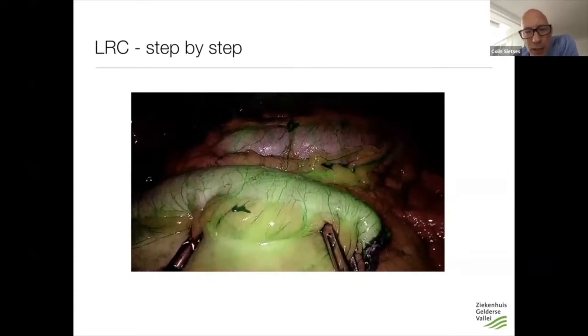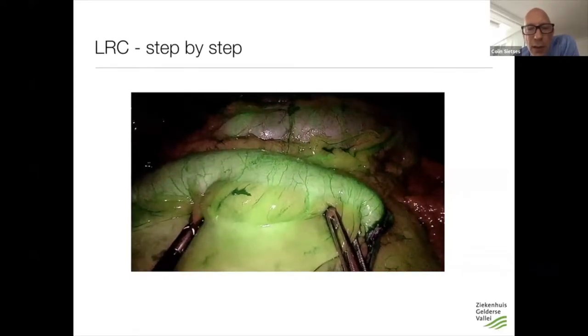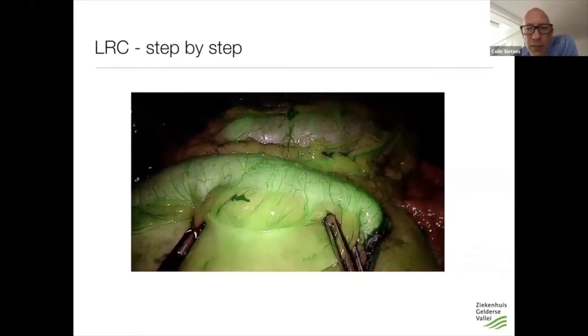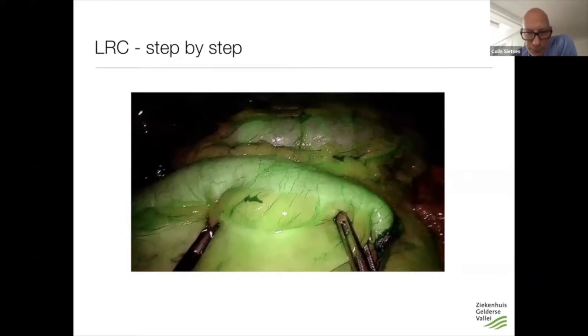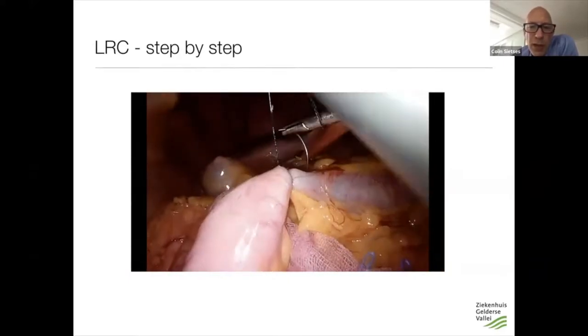We put the specimen in a large endobag and leave it in the abdomen. Then we look with ICG whether there is good vascularization. In this case there is, and then we make a stapled anastomosis.